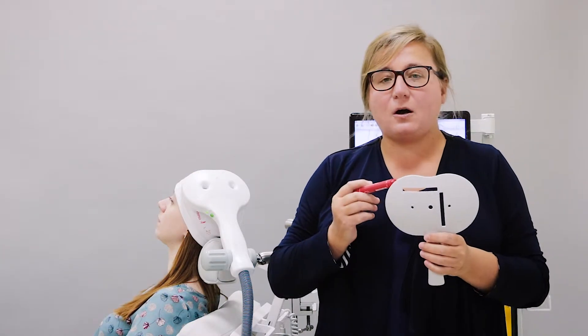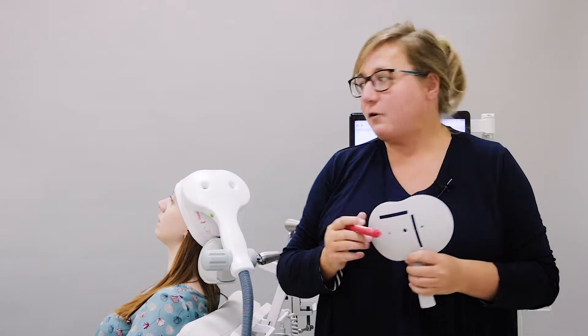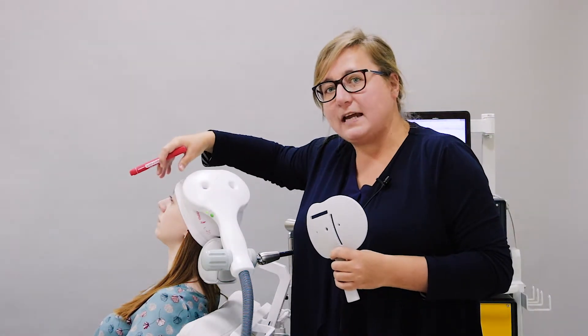Hello, my name is Anna Maslyukova. I am a medical consultant of Neurosoft company, and now I will demonstrate how you can use this coil positioning tool for positioning the coil on the left DLPFC for treatment of major depressive disorder.